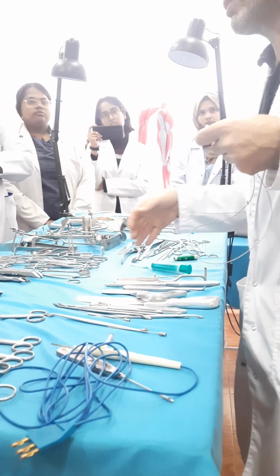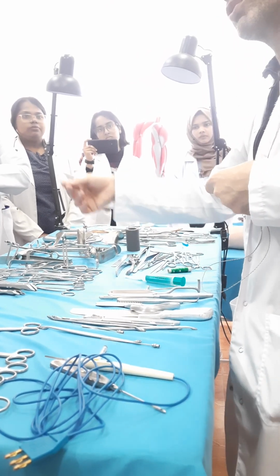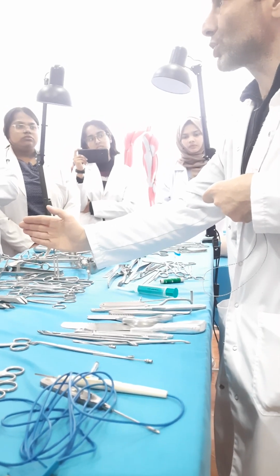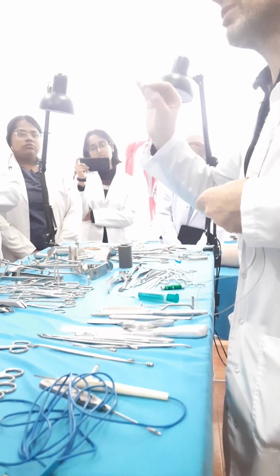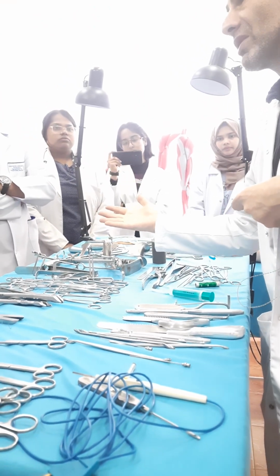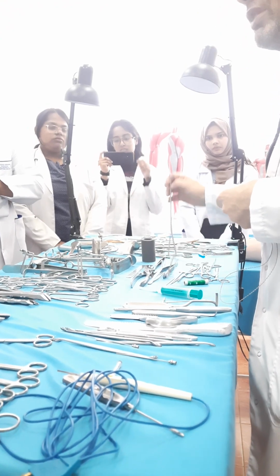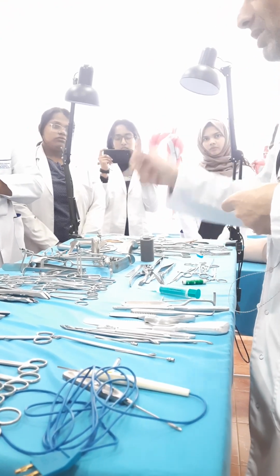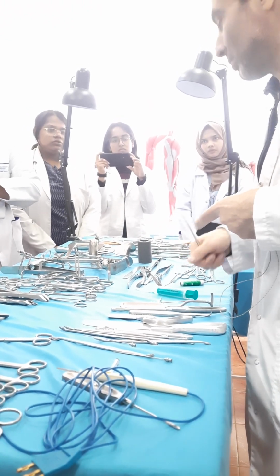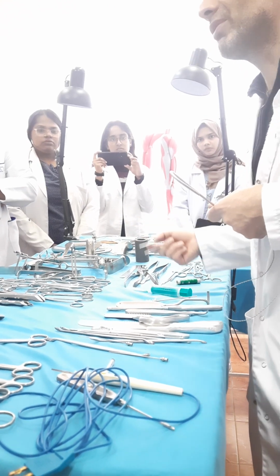Then we see a red piece, it means we reached the diploic layer. We change the sharp tip and put on the ball shape. We continue our work carefully with the ball-shaped tip until we see the white piece of the bone again. It means we reached the internal compact layer. Compact layers don't have vessels. When you reach the internal compact layer, you finish your drilling. You take the probe, like an X, you break the internal compact layer, and using dissecting forceps, you remove the fragments of it from the wound.